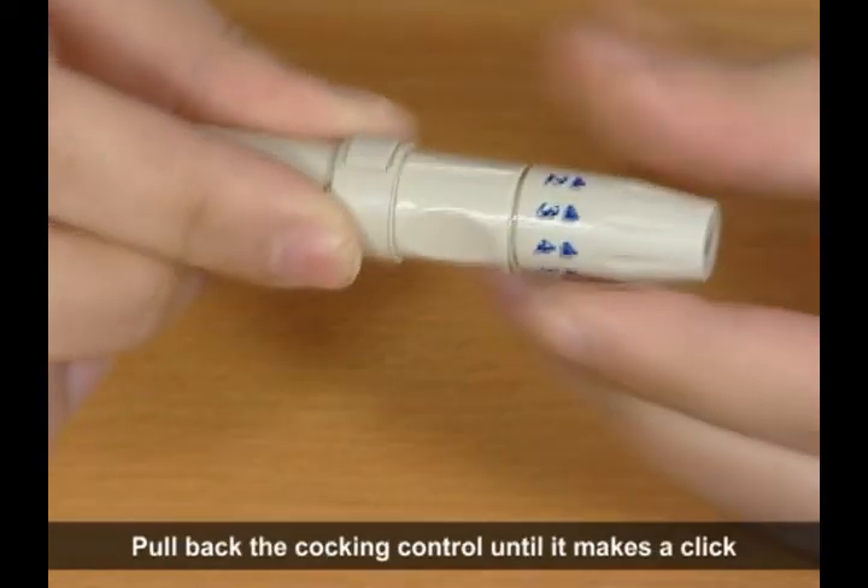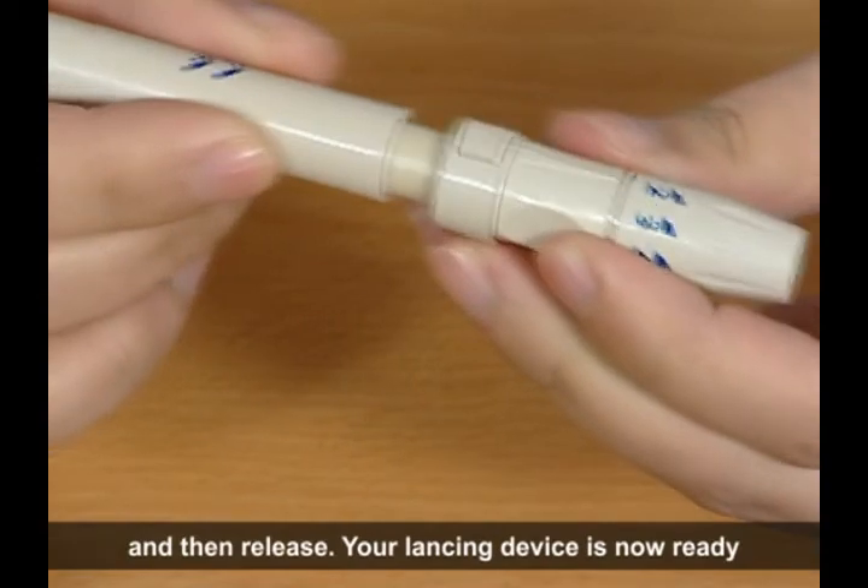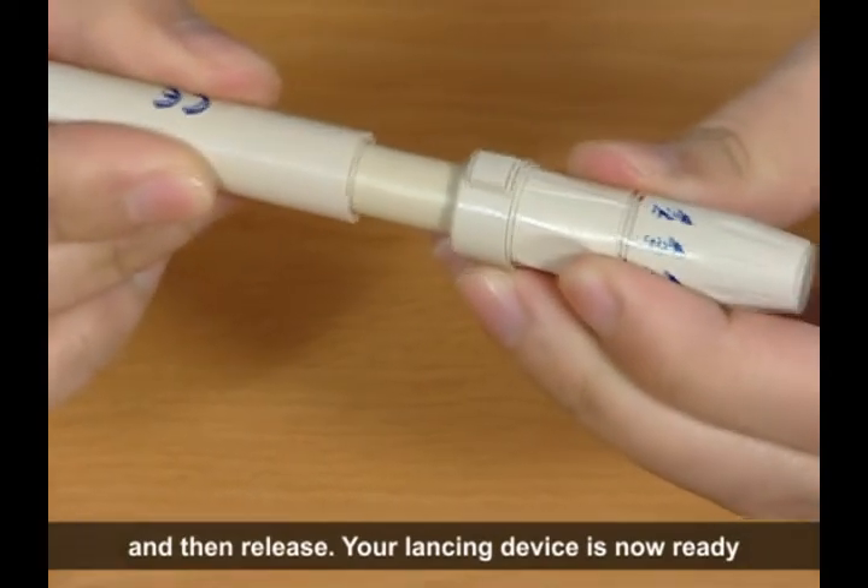Pull back the cocking control until it makes a click and then release. Your lancing device is now ready.